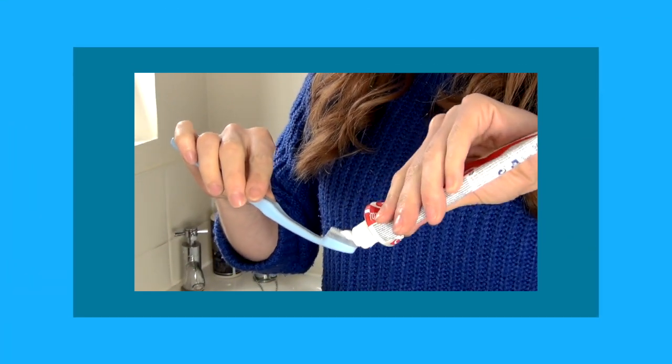Brushing your teeth with the Periclean is a very soft and gentle experience. Just tilt the cleaning head at a 45 degree angle and brush back and forth in short, even movements, concentrating on one area at a time — cleaning the front, back, and biting surface of every tooth.